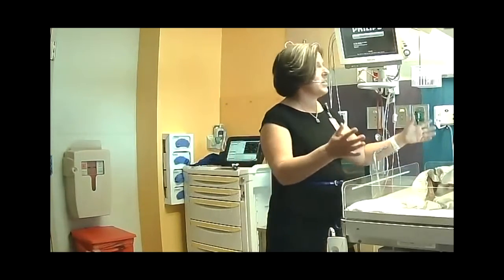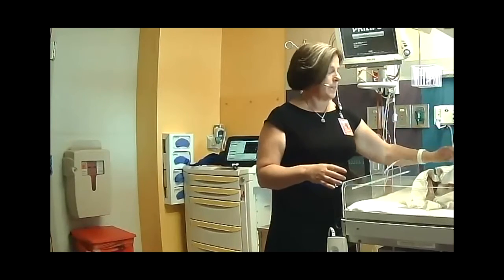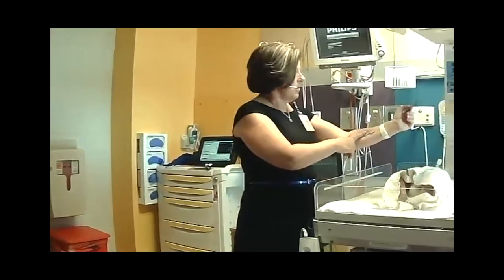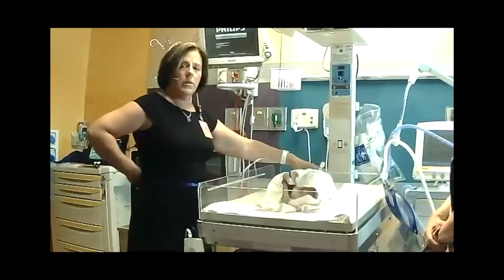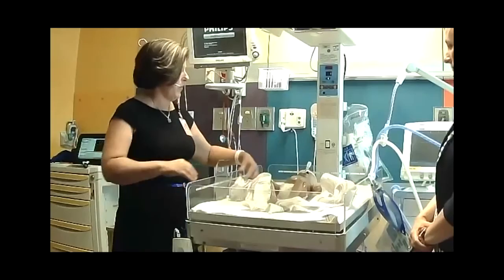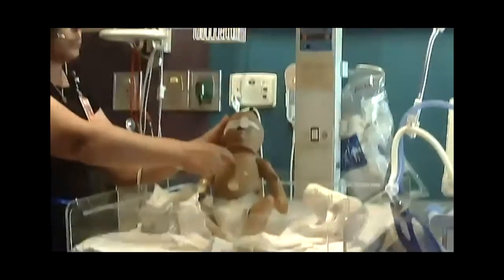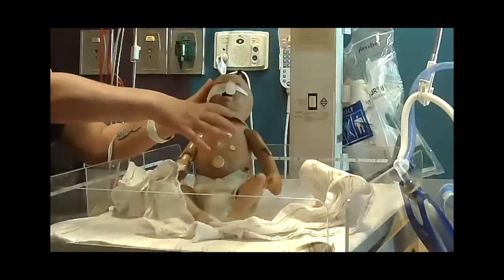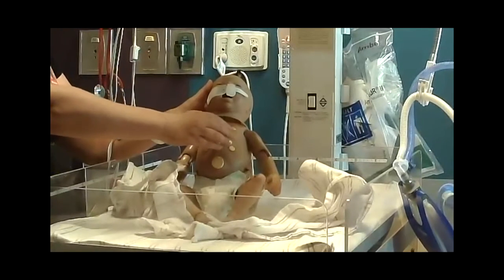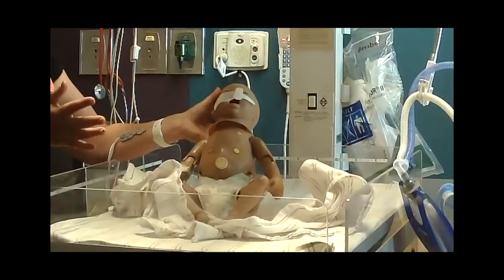So they will come back from surgery, and as a newborn, many times in a bed like this. This bed is a heater and to warm them. Many times with a breathing machine and a tube in their throat. This monitor, you'll see one on their head and one on their kidney. Then in the center, you may not be able to see, but we would have an incision, usually right down the center, because what they do is go right through the sternum and open that bone, okay, to get inside, to get to the heart. That will all be closed if everything is good to close.